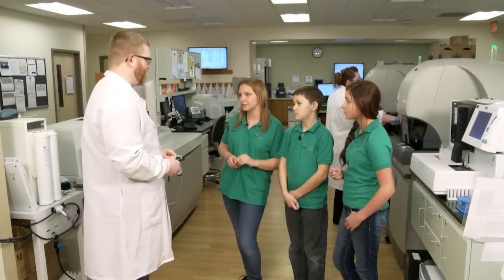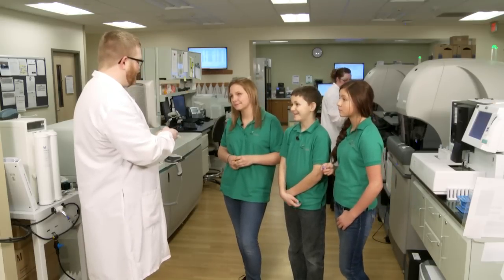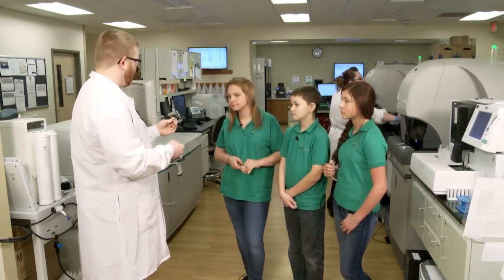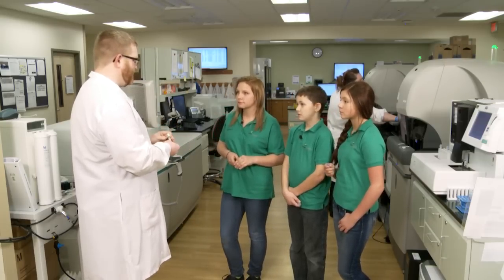How many tests do you think you do on average each year? We probably run about 30,000 tests a month. Oh my gosh! Each tube will run a whole series of tests — so if I put this on the chemistry analyzer, it's going to run 10 or 15 different tests just for that one patient.